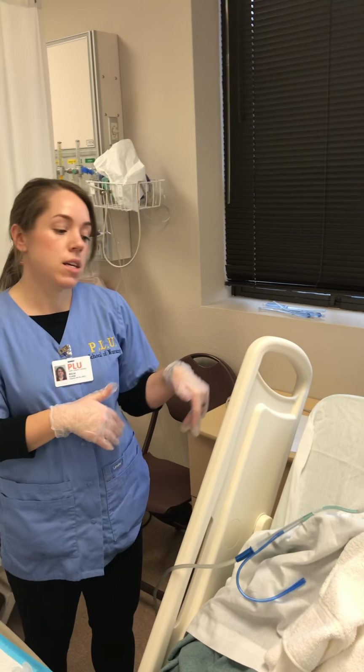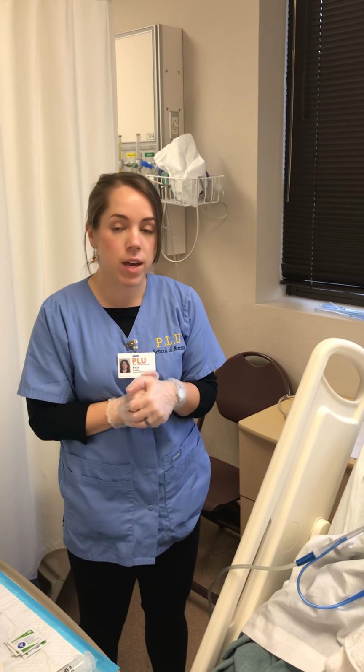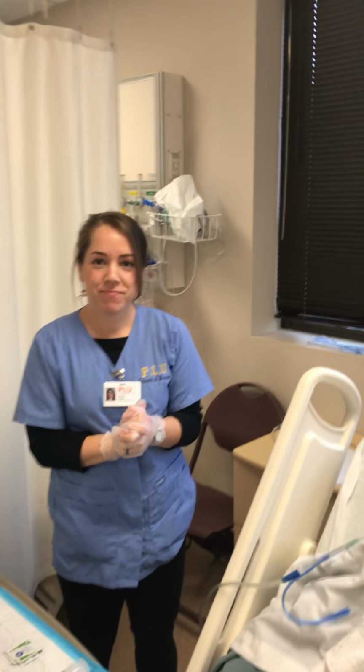And if everything is flowing properly, then I would clean up, make sure the patient is okay, wash my hands, take my gloves off, wash my hands.